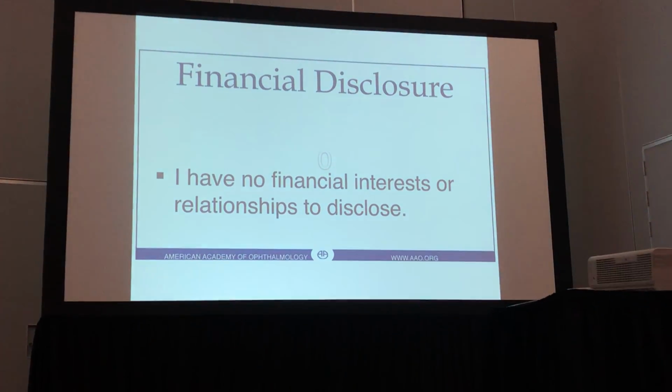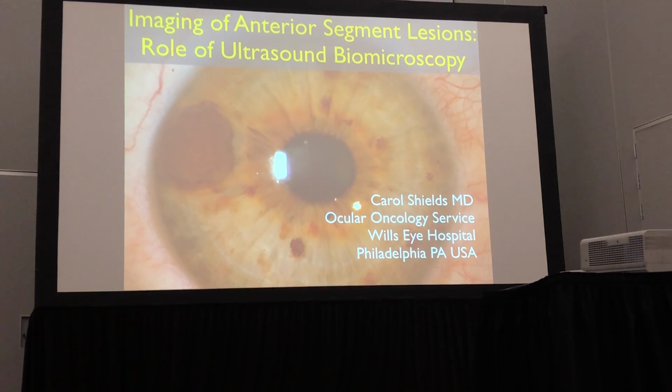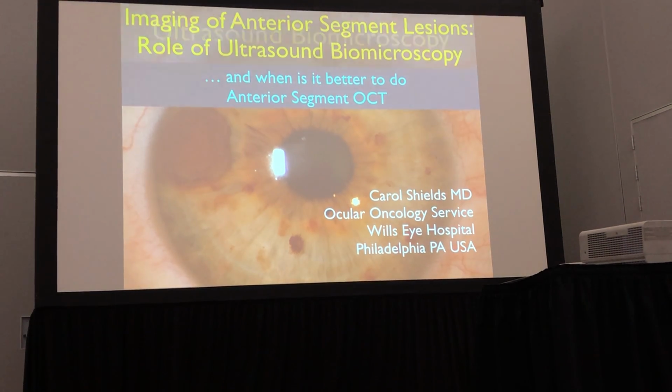I have no financial interest to disclose, and I'd like to talk to you about imaging of anterior segment lesions, the role of ultrasound biomicroscopy, and when is it better to just do an anterior segment OCT?